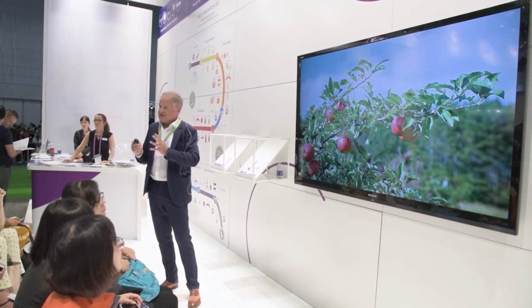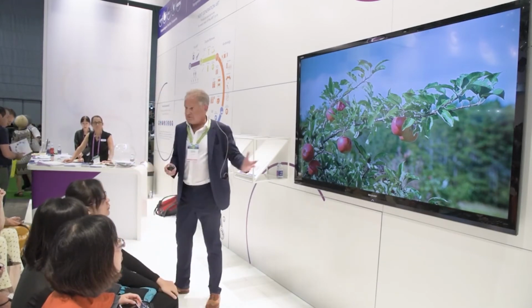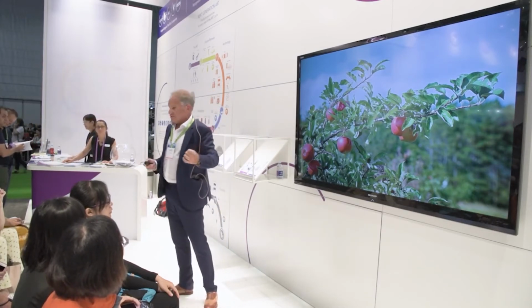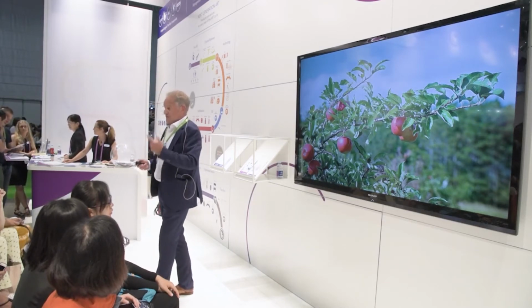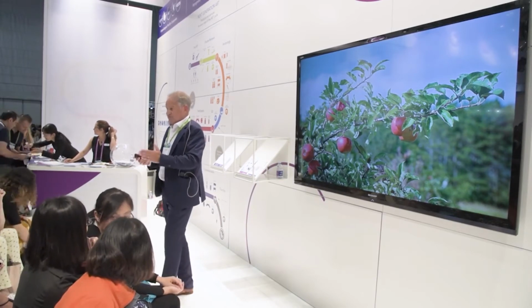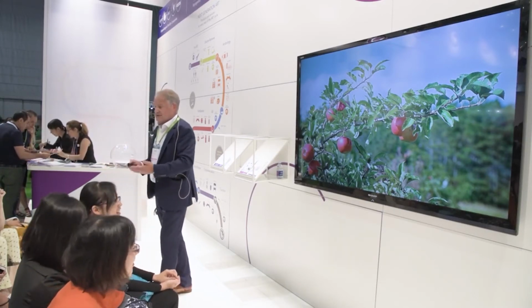So we want eggs that are the appropriate maturity, but I liken them to apples on an apple tree. If you've got a ripe apple, you don't have to spend a lot of time picking it, it'll just drop into your basket. If you have to use force to get your apple, then the likelihood is it's going to be less ripe, it's going to be sour and inedible. And that's the same with oocytes. There's a risk and benefit analysis to be made between the number of times you flush a follicle and the damage you create and the pain you subsequently create in the patient, and whether you just aspirate.